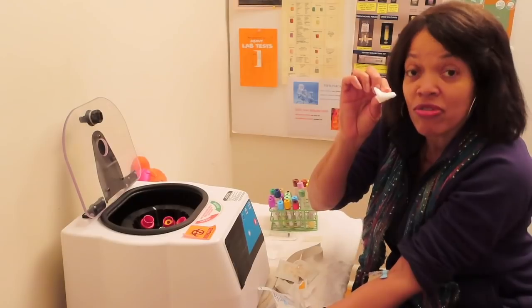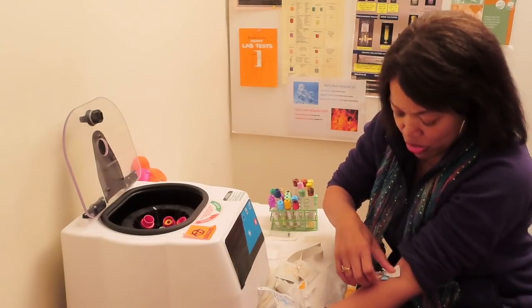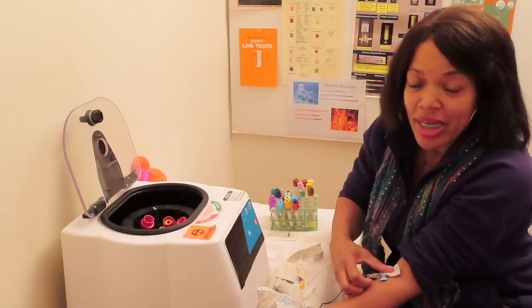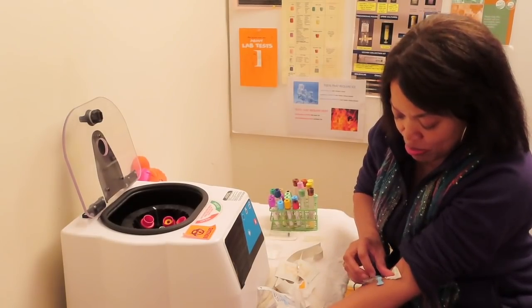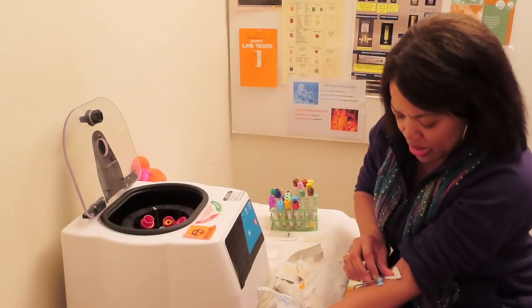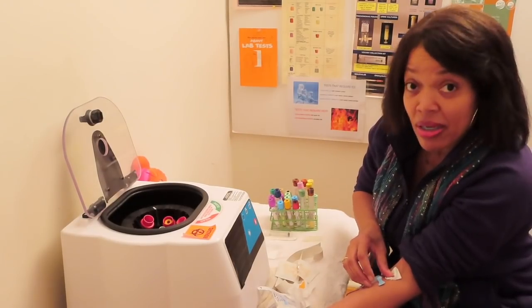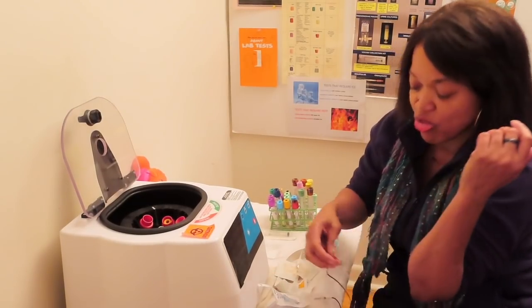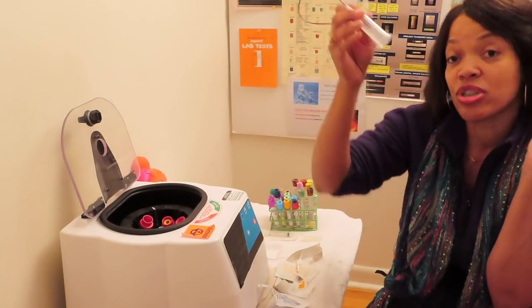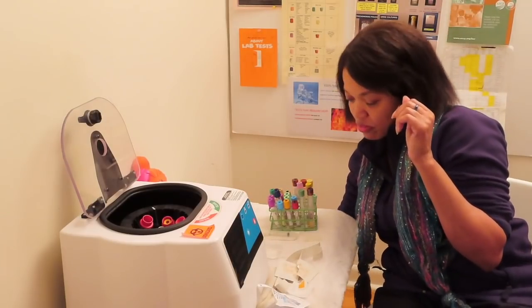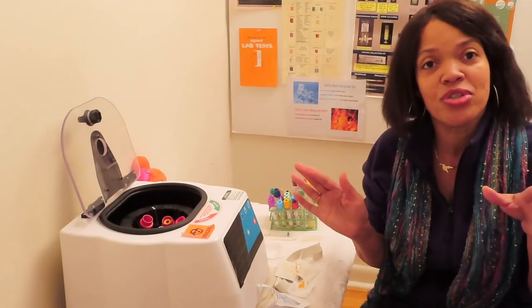And you get yourself a nice gauze. You place it over the site. Pull that needle out. Everyone has their different method. When you pull it out, you can go ahead and hit the button. Heard it? Yes. So needle is retracted. And voila. There is no exposed needle. And of course, this goes into your biohazard bin. And you're done with your stick.